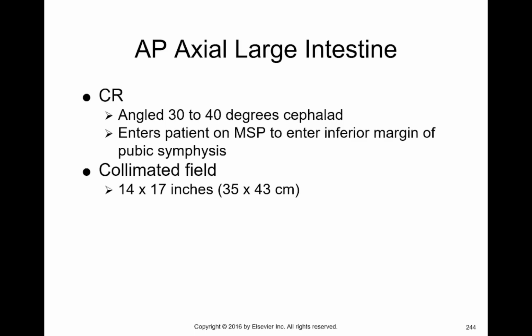What you can do, though, is to use other body landmarks to determine where the symphysis pubis is. Greater trochanter should be at the level of the symphysis pubis, so you can base that on the hip. Also, the distance between the ASIS and the symphysis pubis is about 4 inches. So those would be my recommendations rather than palpating the symphysis pubis.